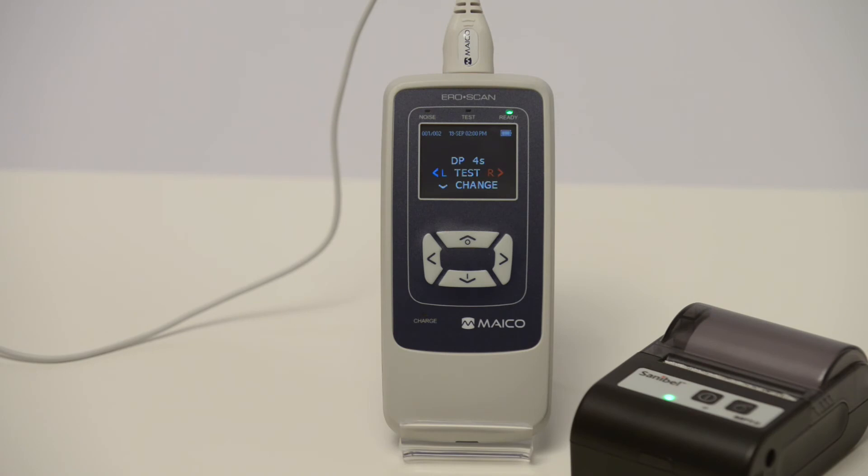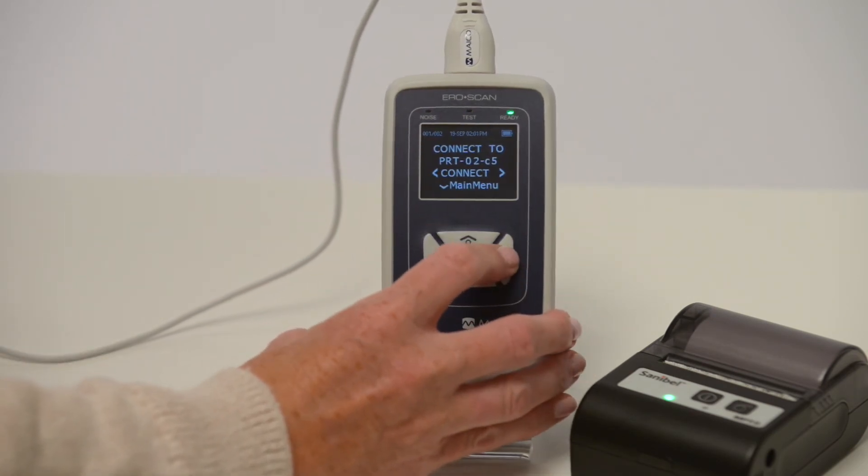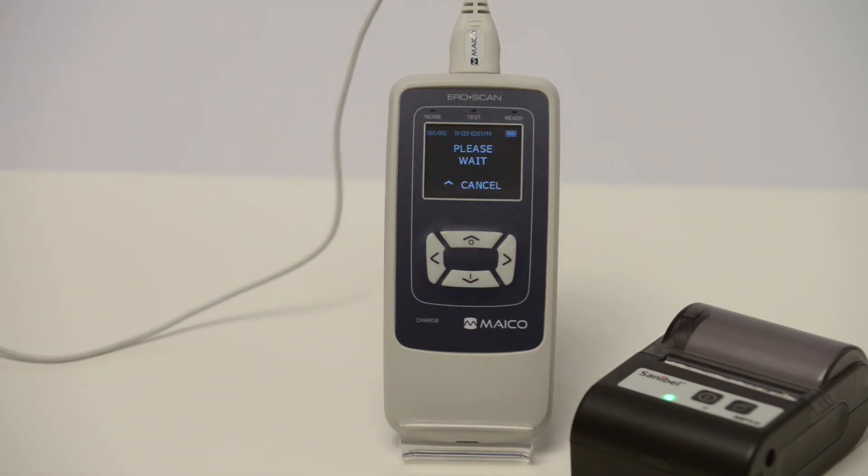To print results on the wireless printer, turn the printer on and press up arrow until printing screen is displayed. Press left or right arrow and results will print.